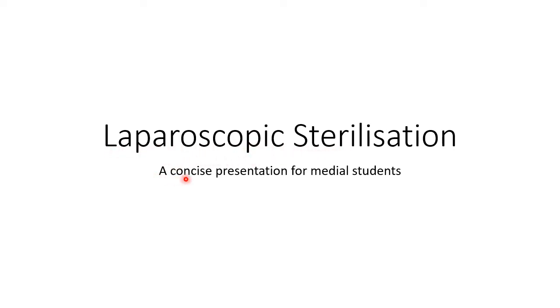This is a concise presentation for medical students. Laparoscopic sterilization is a permanent method of family planning. It is also known as laparoscopic tubal ligation.